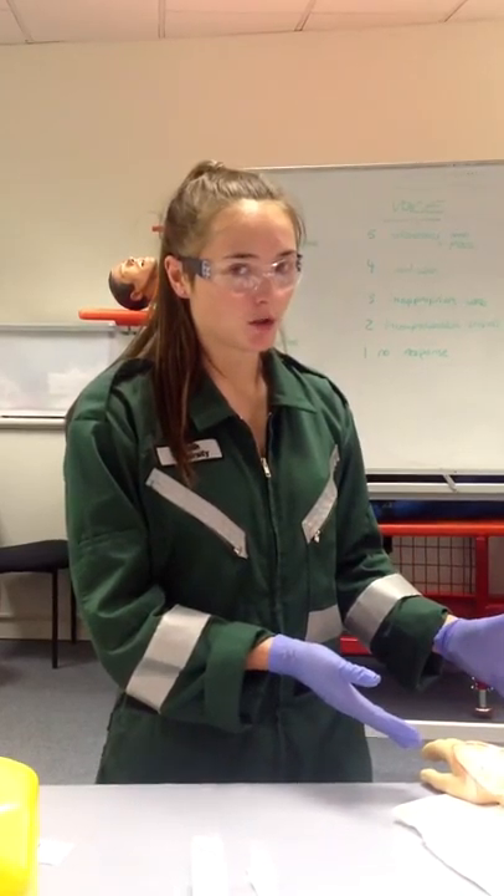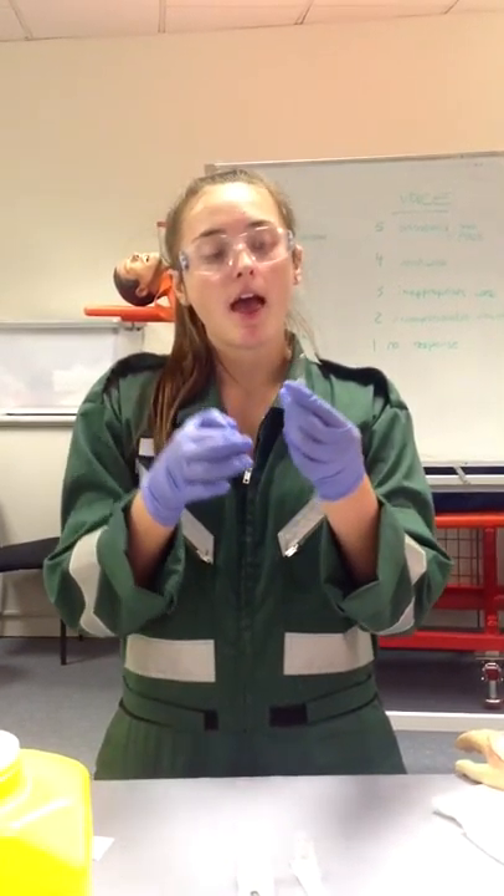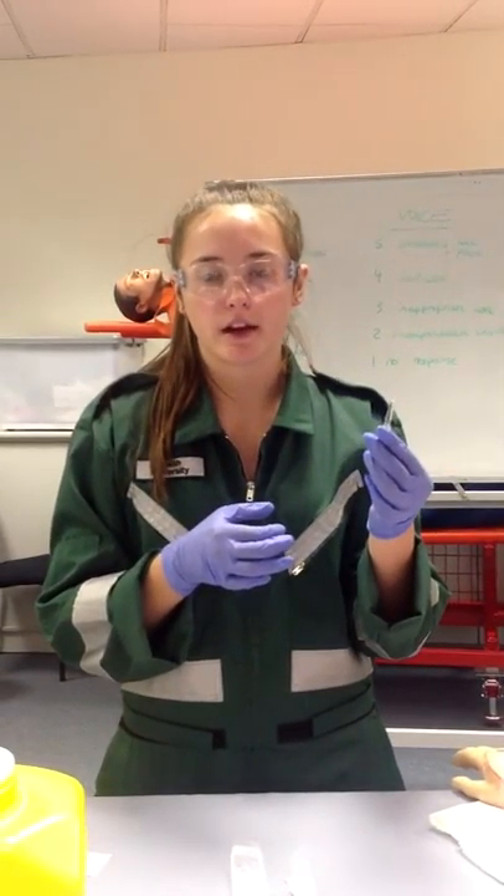My name is Jade Taylor and I'm going to do a drug draw-up and how to insert it into a patient. Today we've got some adrenaline, one milligram in one mil. It expires on the 8th of 2019.